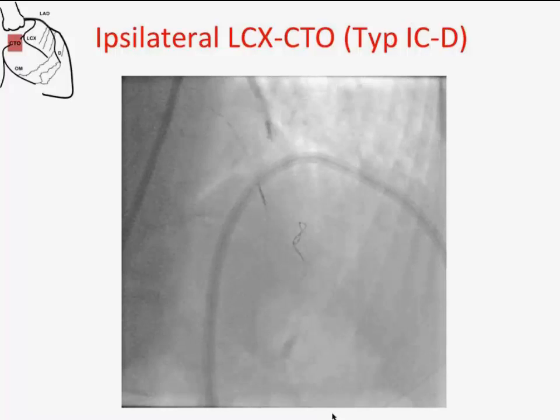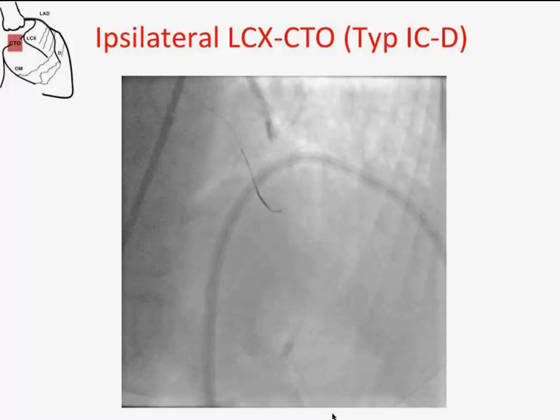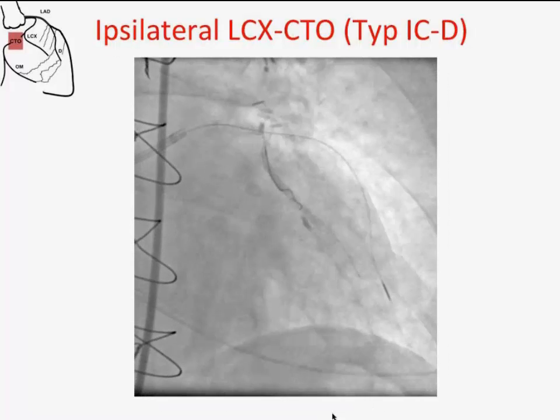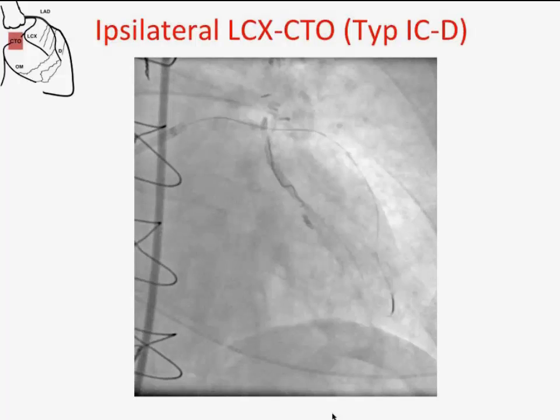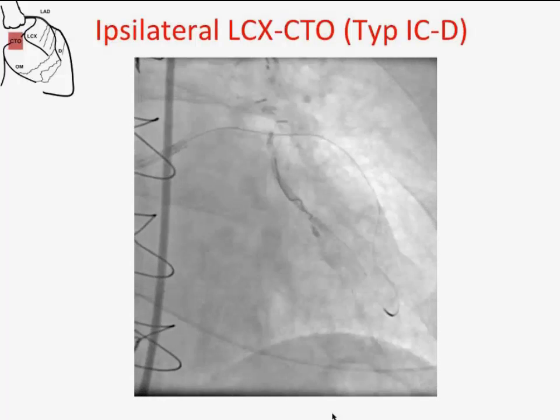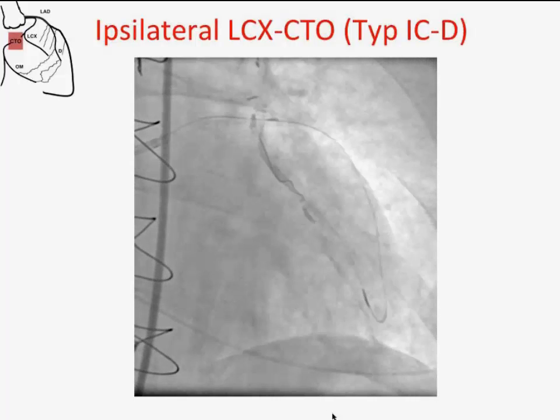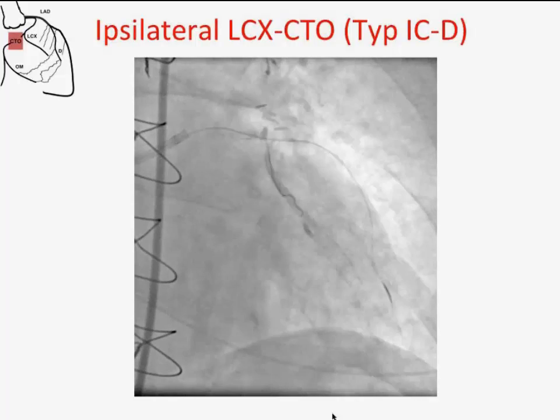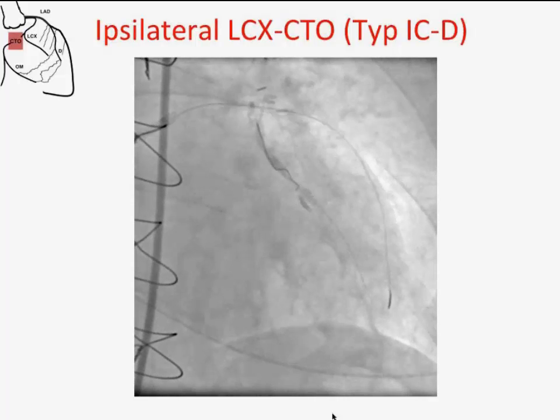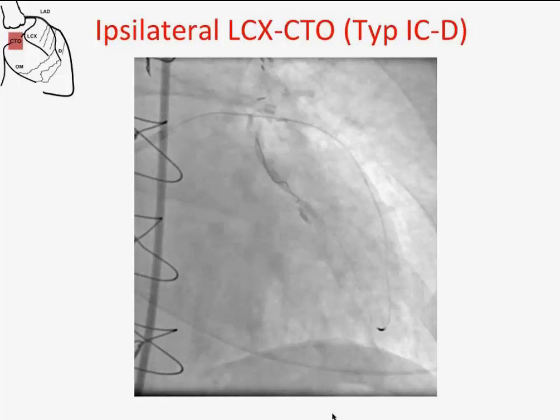I have another example, and this wire stays in the... I mean, we can't recommend this for sure to everybody. We shouldn't say that's a general recommendation, but I can show you another case afterwards. So finally, you can see how the Turnpike LP went up retrogradely, and then the wire ended up in the bypass, in the vein graft.